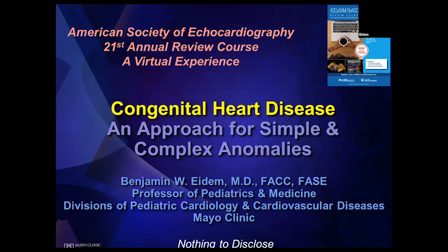What I'd like to do over the next two lectures in this session, in our first lecture, is to discuss a systematic approach to imaging a patient with congenital heart disease. Then we'll go through some simple congenital heart disease cases to illustrate this approach. In my second lecture, we'll discuss some more complex congenital heart lesions and how we image those and how our imaging helps in patient management.